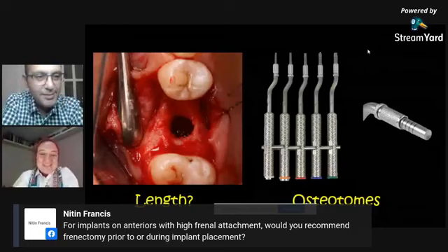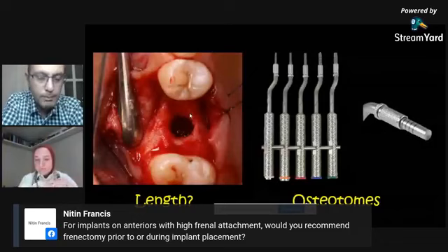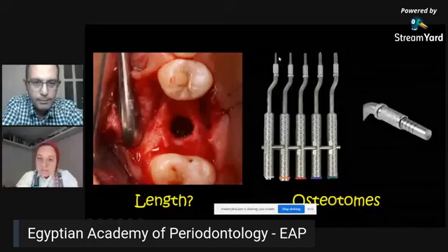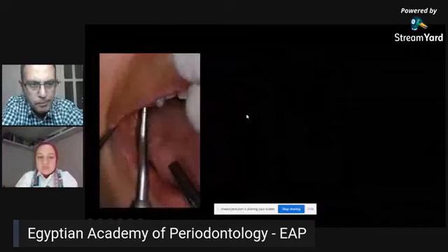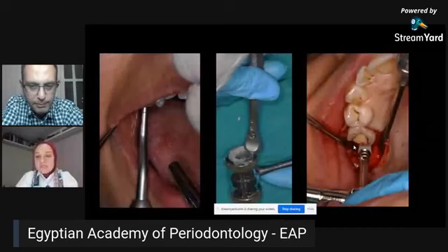Okay. So again, I was saying that if you are still a beginner with this technique, maybe it's your first time to do it, even if you placed a lot of implants, we can go for a 2 millimeter safety margin and then you stop. And then you use the osteotomes, that have marks here, and you can adjust this stopper on the length of the implant you're going to place. Usually it's a 10 millimeter implant, and you go inside of this osteotomy with the osteotome, and you start hammering on this osteotome with the mallet. And then you achieve the length you want, and then you place the implant regularly, like any regular implant you place.